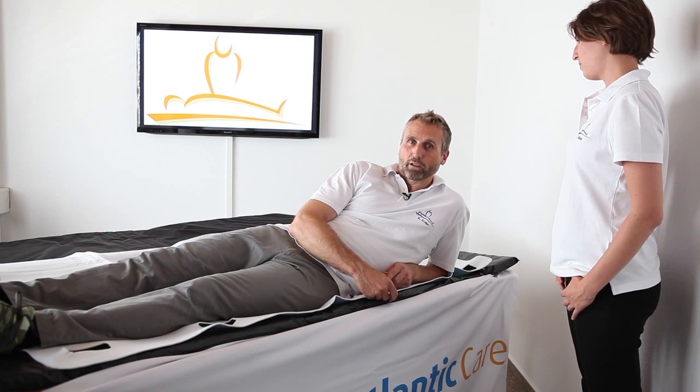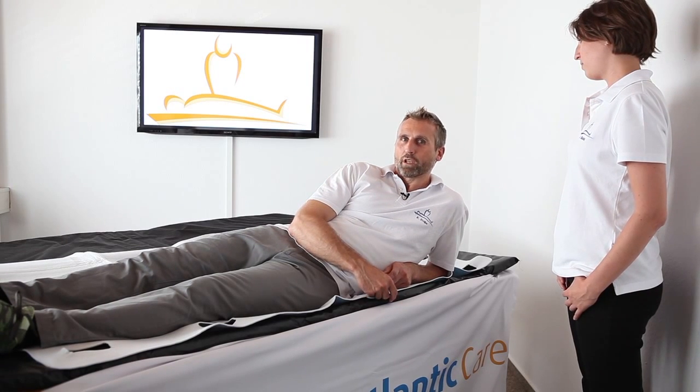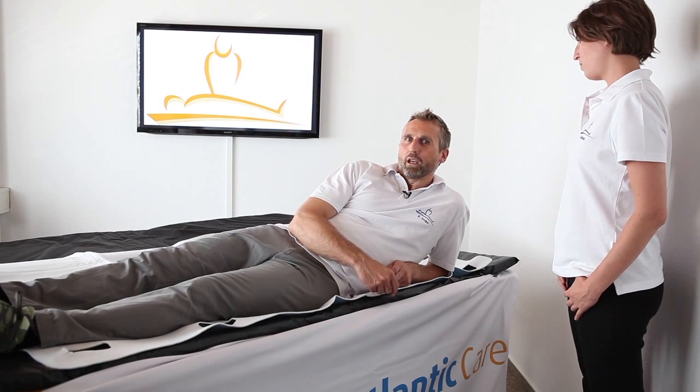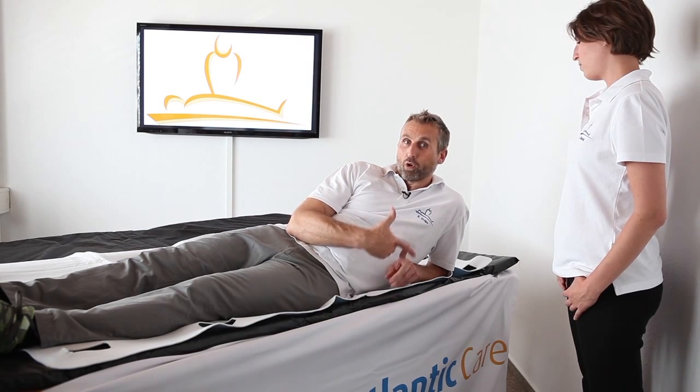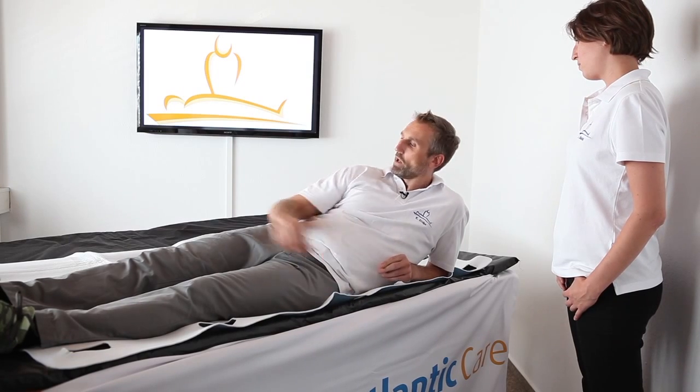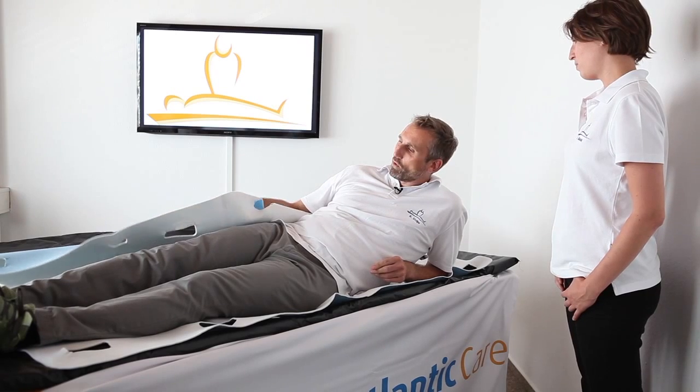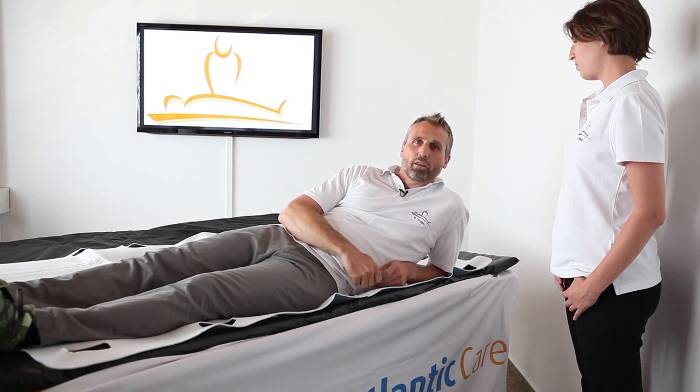This one is my favorite. We'd like to show you and demonstrate how our PTS EVO works — not only our board, but also our XXL carry cloth and the gliding foil on top of the roll board. So all three together in the transfer. Enjoy.